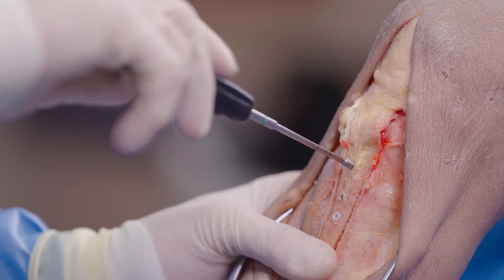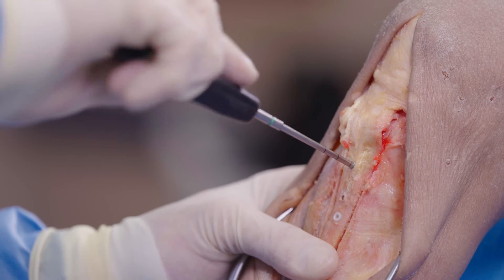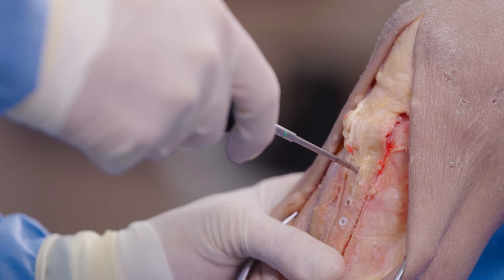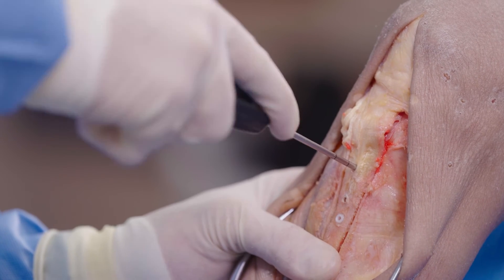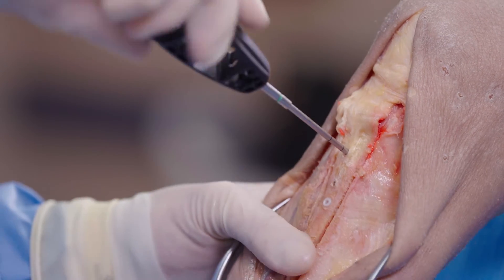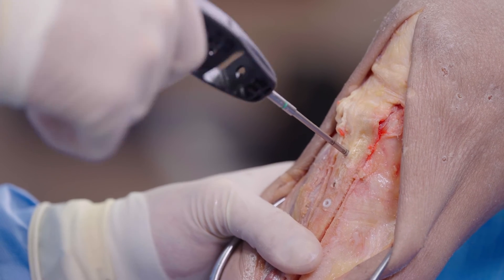It's easier to do under hand — once again, you can find that far cortex with more tactile feedback. I'm measuring now. This is a small specimen, and it looks like at this part of the depth it's a little wider. Why don't we go up to a 38-millimeter on this one?